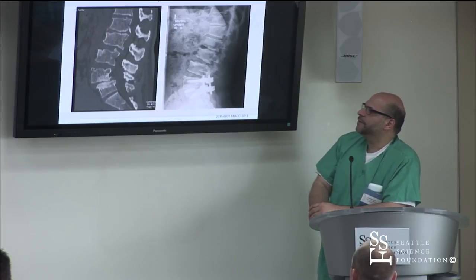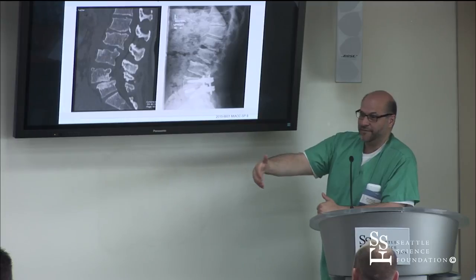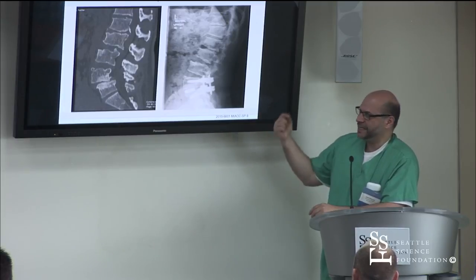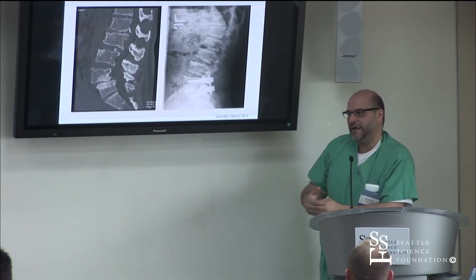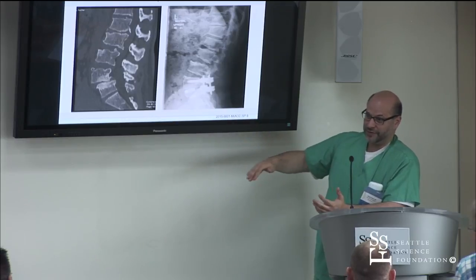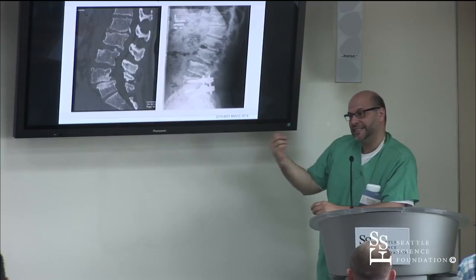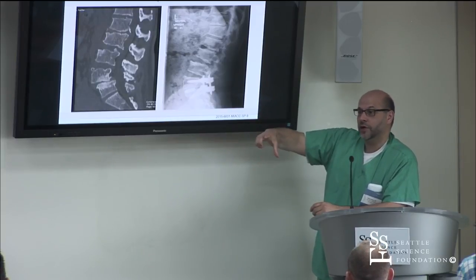So the contralateral screw rod is a backup for me. I haven't had to do that in a long time. But for those who are really stiff and really rigid, and I get in there with my paddles and it's not moving, then I'll do that. I'll go down and put the tube down, I'll take down the other joint. Her case, she had bilateral pars defects and she was mobile in the back. But if they're not, you can take down the other joint. You can put your contralateral screws in with a rod that's a bit longer.